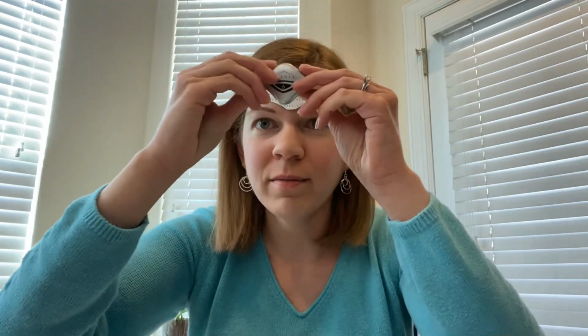If you can see, there are two little magnets in the middle of the electrode. And what you're going to do is take the actual CEFALY device here. On the back of that, you can see there are also two little magnets. That's how the device connects to the adhesive. So you just pop it right on.